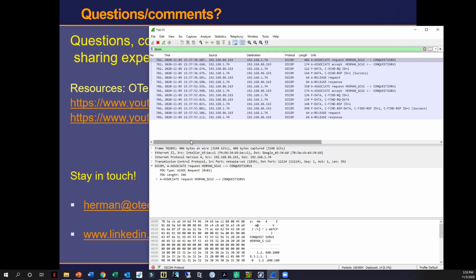Awesome. So you mentioned the PET/CT case. Can you talk through how that could also be stored as a single study with PET series and CT series, and perhaps population of the modalities in study field? Very problematic, yeah. First of all, for PET-CT, the PET and the CT should have their own study identifier, right?